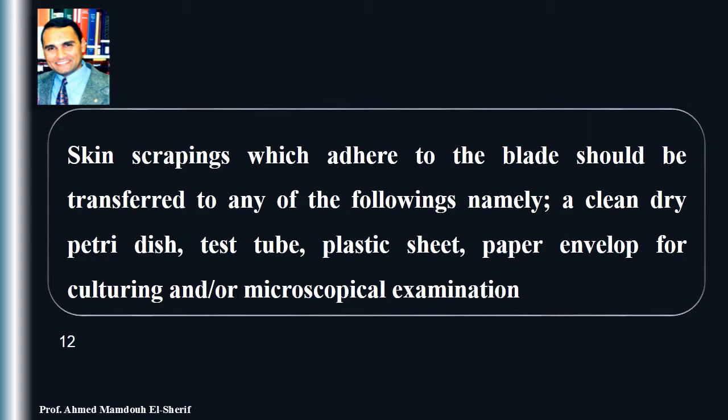Skin scrapings which adhere to the blade should be transferred to any of the following, namely a clean dry petri dish, test tube, plastic sheet, or paper envelope for culturing and or microscopical examination.